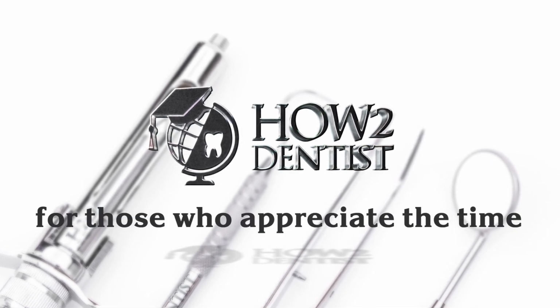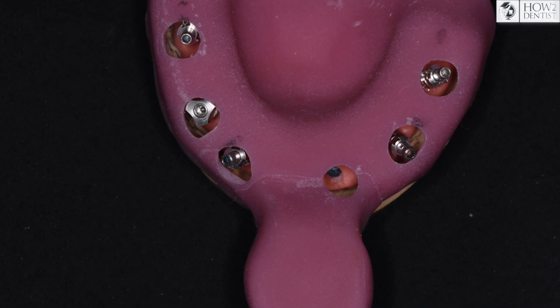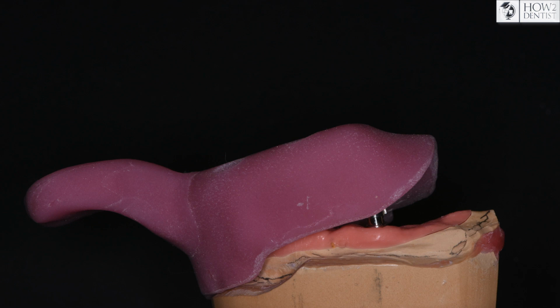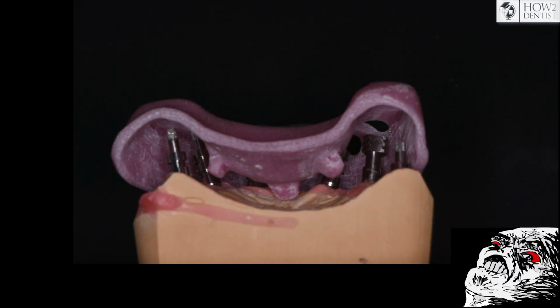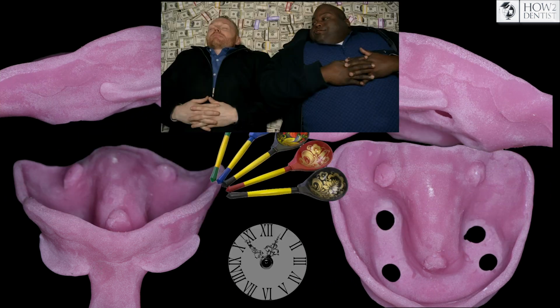Hi, this video is based on many moments when the custom tray was more frustrating than helpful in the work. This special episode is about errors and rules for the making of a custom tray according to the dentist's opinion. And even though our videos are free, we will help you to save your money and time.